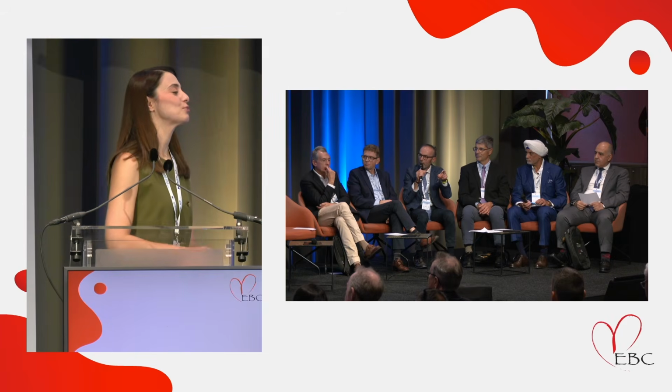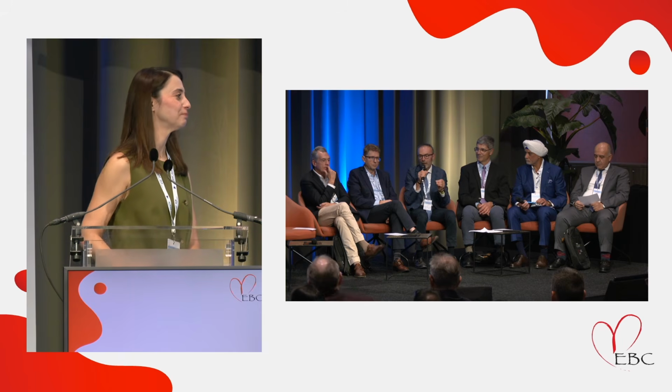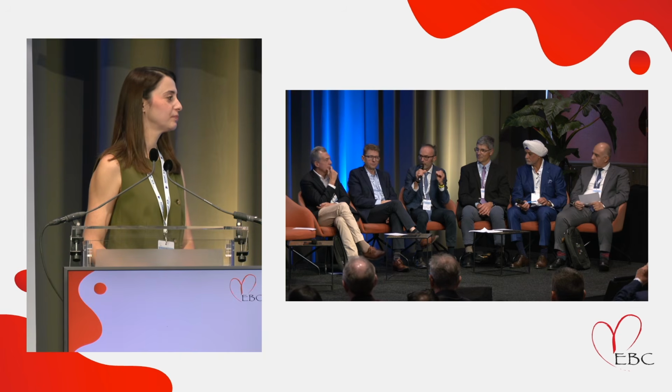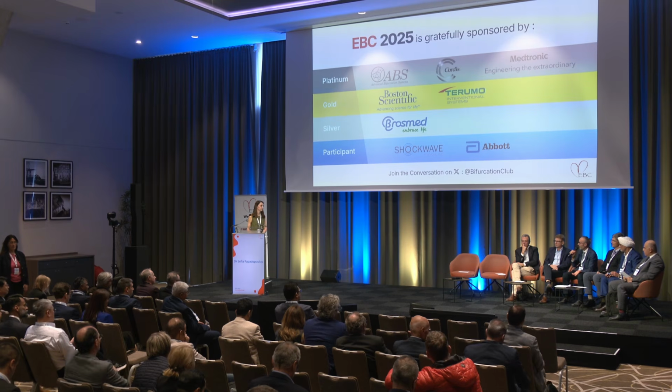This was a statement: zero tolerance for stent under expansion. In my presentation, this is the first slide. When you have ostial LAD or ostial circ, remember that ostial lesions are fibrotic or calcific. So lesion preparation is very important, and the stent should be well expanded, otherwise there is the risk of stent under expansion, which is zero tolerance for me.